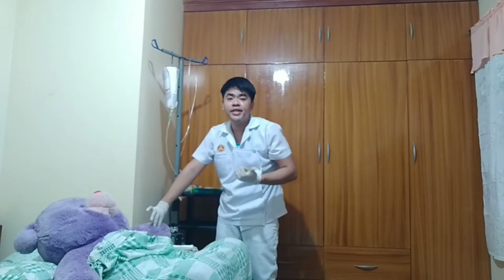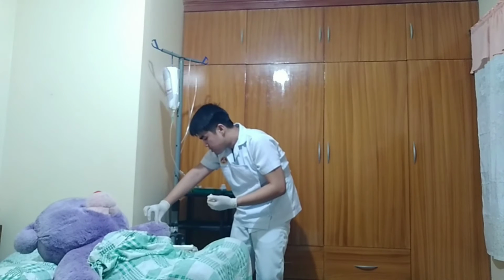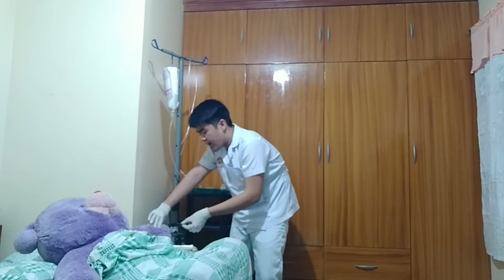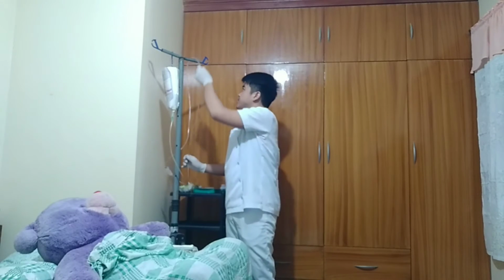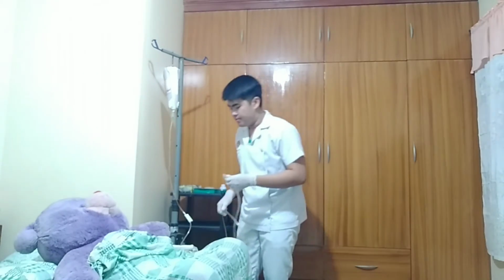And using the index finger and thumb of the non-dominant hand, we're going to stabilize the tab of the needle. And then we're now going to remove this stylet and place it in a container. And then we're now going to insert or connect the intravenous tubing to the needle.